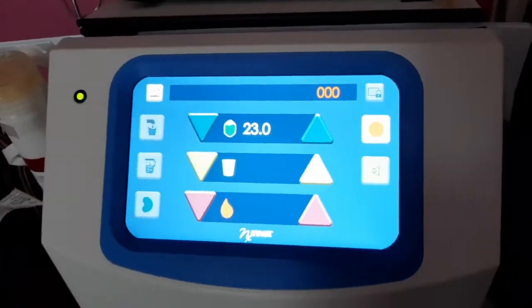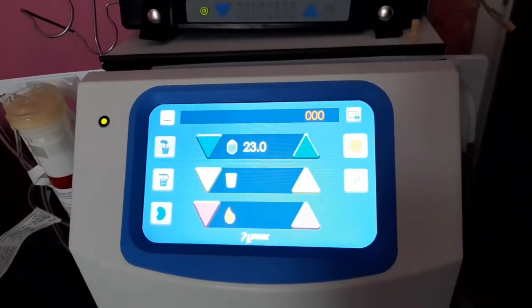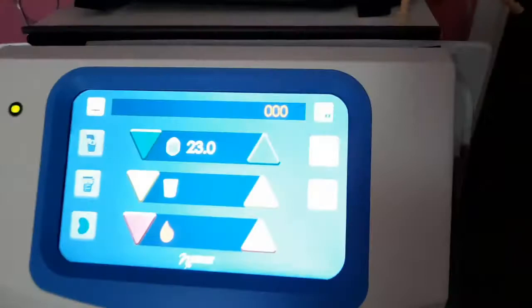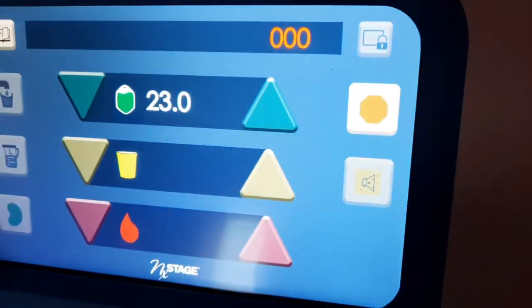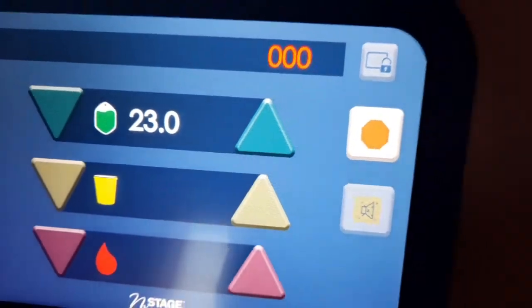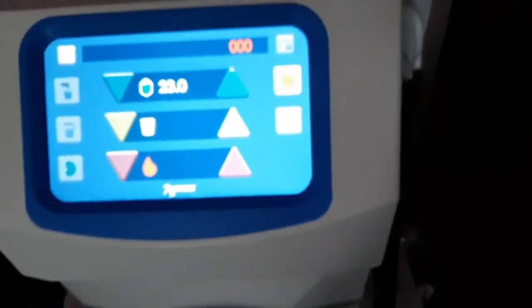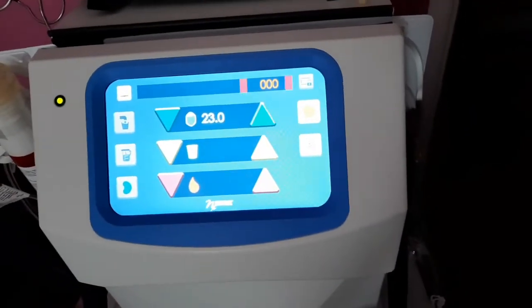So now it's time to snap and tap your lines before we hit the stop button. The stop button is lit. It's the only one that's lit, but you do not press it until you do your snap and tap. Okay? So, I'll be right back.